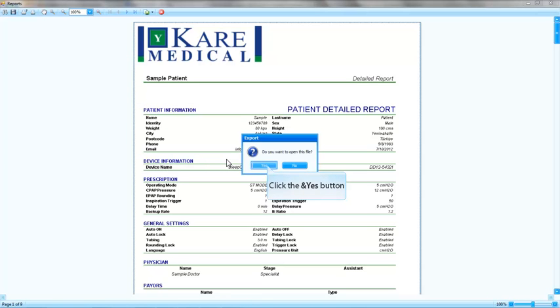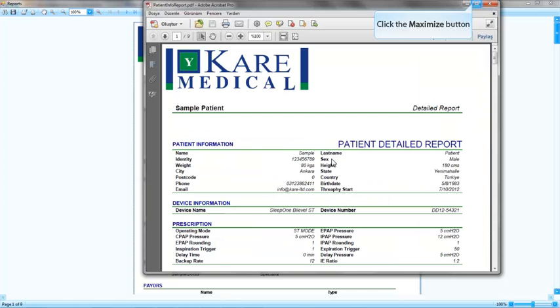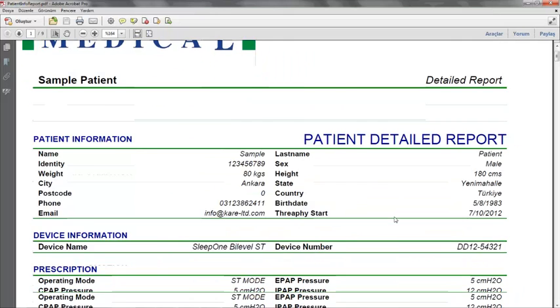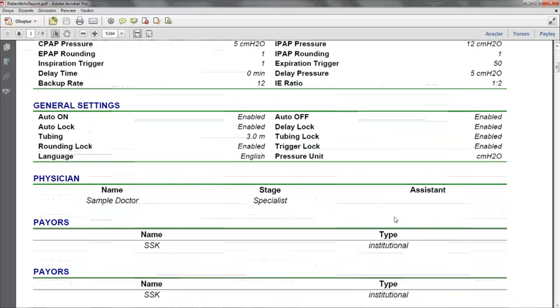Let's have a look at the PDF file we have generated. Here is the PDF file.